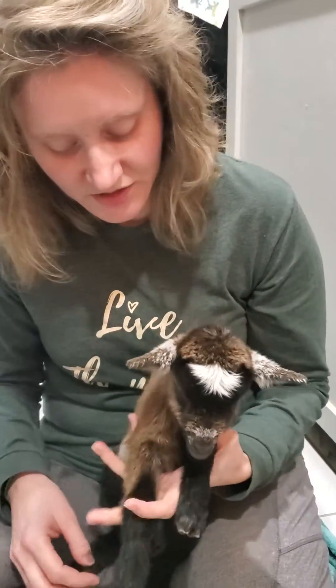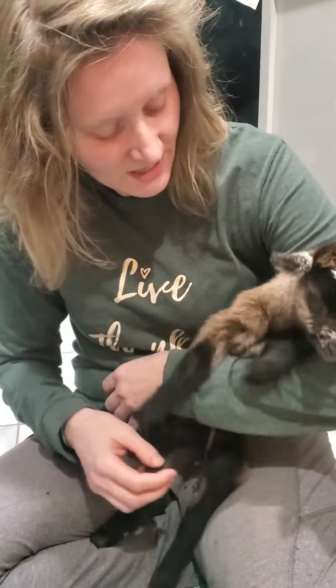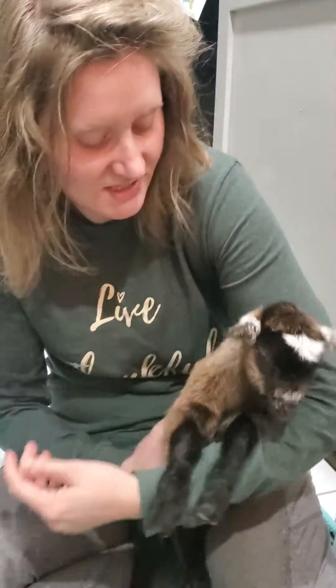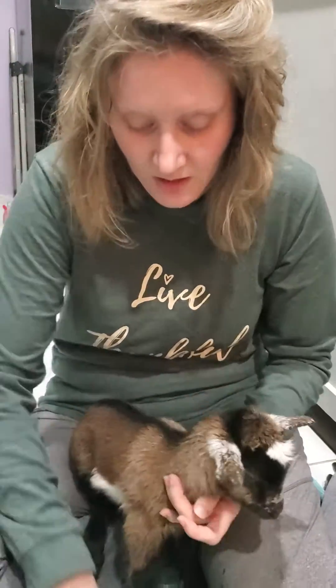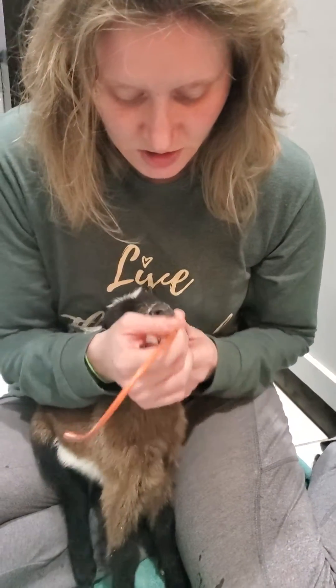This is a tutorial on how to tube feed a goat kid who won't suck. You can do this for very weak kids or for kids who are just being stubborn. I like the Save a Kid tubes from Jeffers.